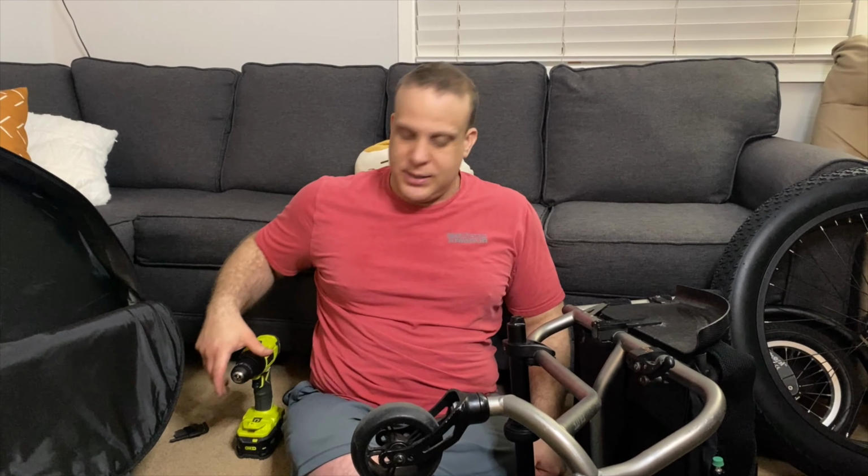So I just want to let you know, guys, that sometimes with wheelchair maintenance, when I'm trying to do these types of things, or when you might be doing some of these things, it doesn't always go as planned. I thought I'd simply loosen these bolts on my side guard and slip it up, and I had a bolt that was stuck. So you just have to be patient and think through it so you don't break something.